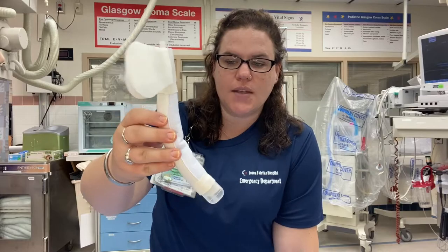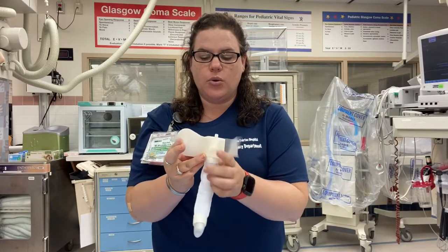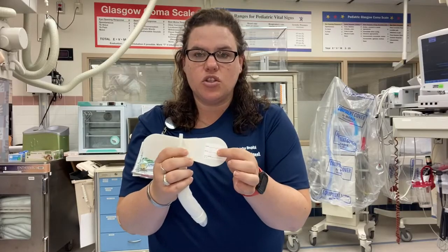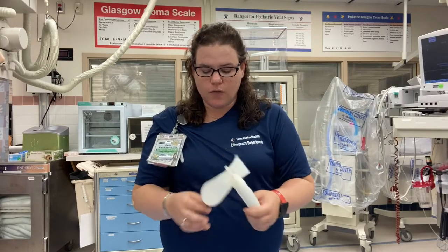You're going to place it and curve it to your patient's size and shape. Then when you have it in the proper place, you're going to take the adhesive stickers off and stick it across the top of the patient. Please make sure that you date and time when this is placed, especially if your patient's going to be admitted so that the floor knows how long it's been on and how long it's good for.